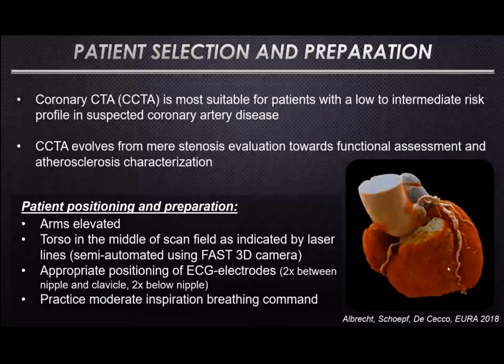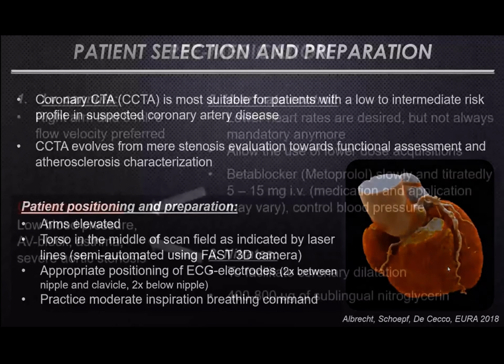Also important, and very commonly forgotten, is to practice the moderate inspiration breathing command with the patient in advance. So I always tell the patients that it's not like when they would like to completely breathe in, it's just like a relaxed, moderate inspiration, and tell the patient yourself to stop breathing, hold the breath, and breathe normally. And once you practice that, the patient will also be able to reproduce this in a very consistent and relaxed way during the scan acquisition.